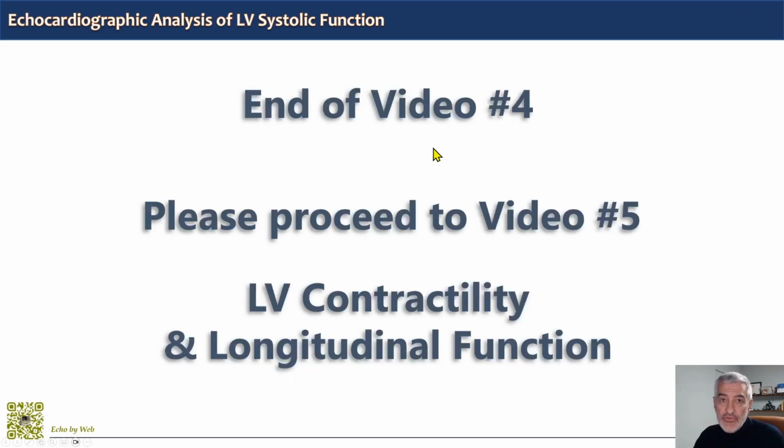And this is the end of video number 4 of the echocardiographic analysis of left ventricular systolic function. Please proceed now to video number 5, which will deal with the non-invasive estimation of left ventricular contractility and longitudinal function.